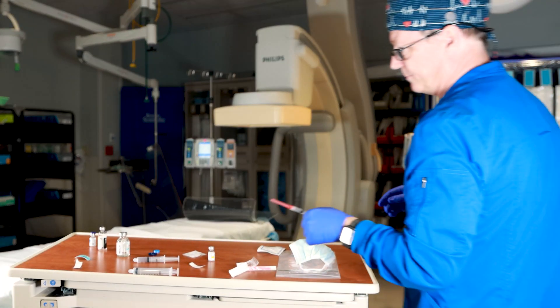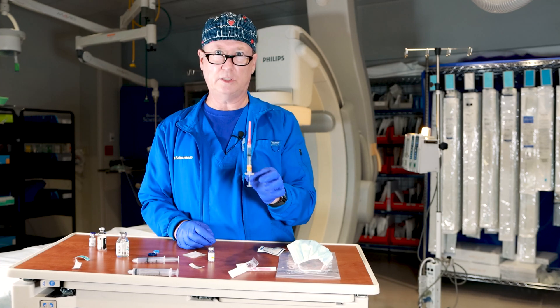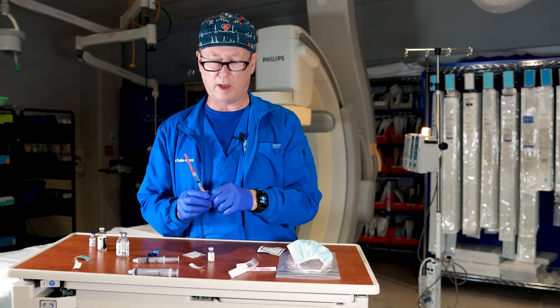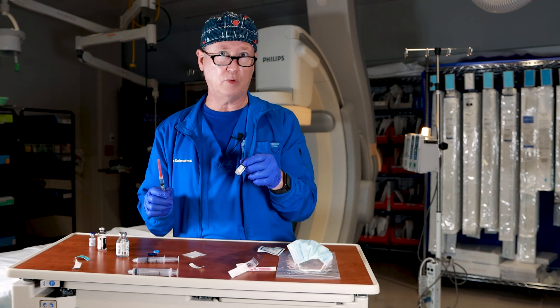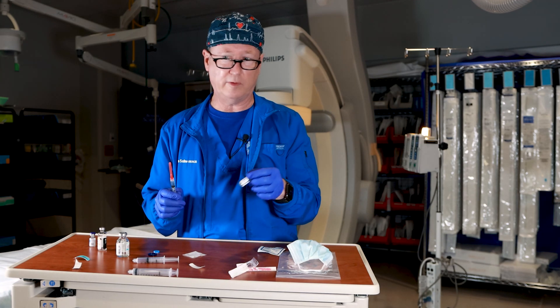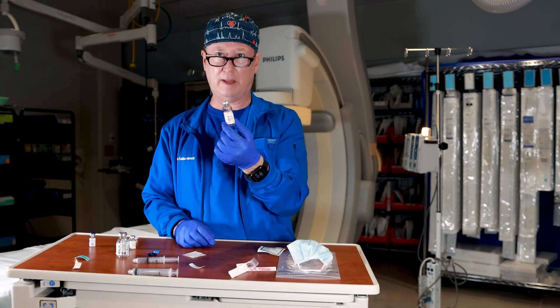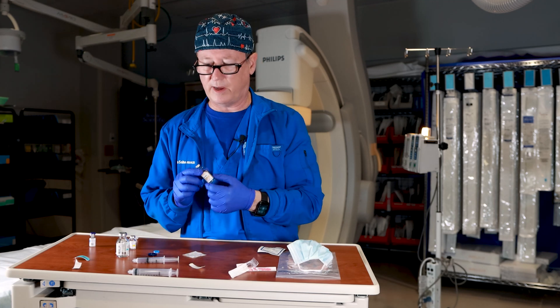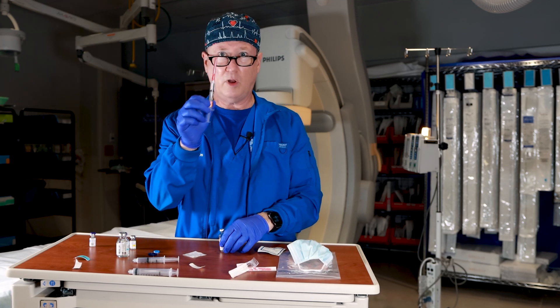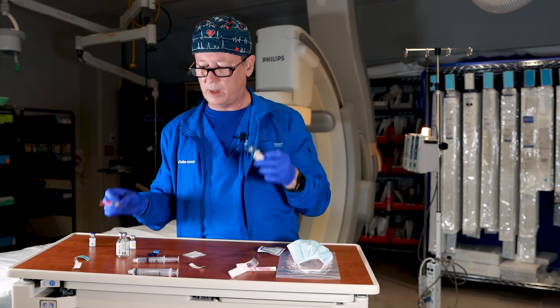The three cc syringe is the right tool when giving medication that typically comes in two cc or one cc vials. Now if you have medication like heparin — 10,000 units in 10 cc's — you certainly don't want to use a three cc syringe; you can't draw it all up.